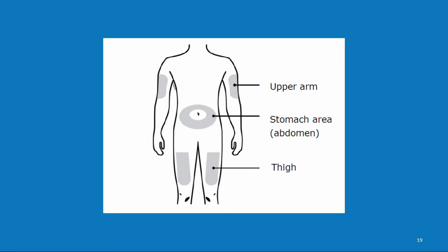After you have collected the materials needed for your injection and allowed the autoinjector to come to room temperature, wash your hands with soap and water. Next, choose an injection site. The following areas of your skin are recommended: your thigh, your stomach area at least 2 inches away from the area around your navel, and the outer area of your upper arm. If you choose to inject in your upper arm, you should have someone else give you the injection. The Alirocumab autoinjector has a very short needle, so the injection goes right into the layer of fat just under your skin — this is called a subcutaneous injection. Wipe the injection site you choose with an alcohol swab and allow the skin to dry.